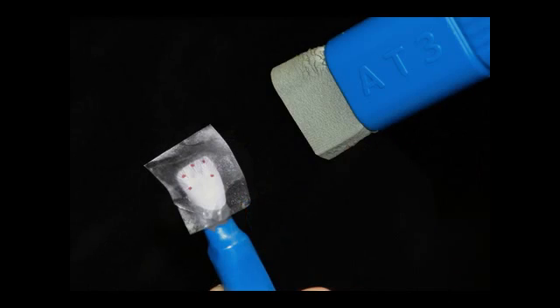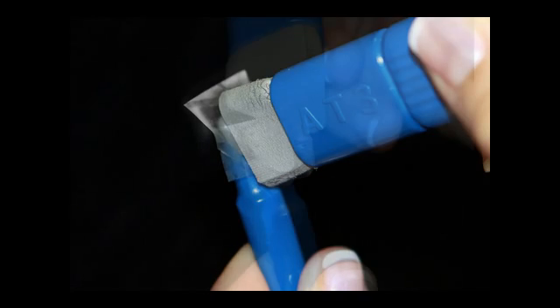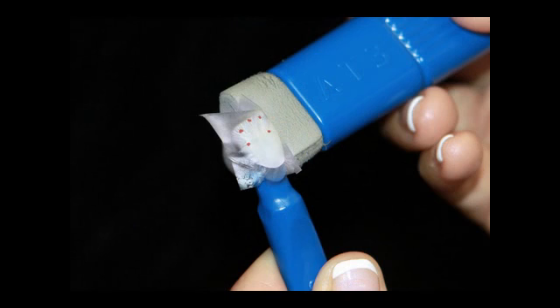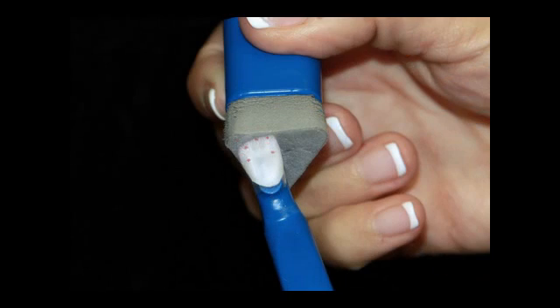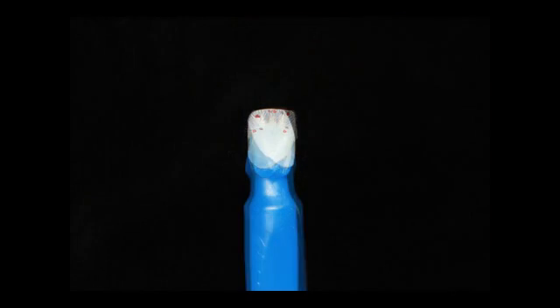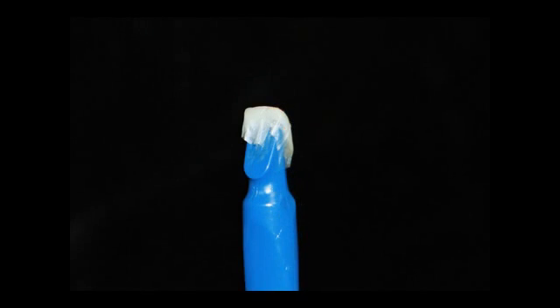It is very important to avoid trapping any moisture or air bubbles between the Gila digital transfer and the surface of the tooth, as this will cause a bubbling effect on the final result. Do not worry about any extra material past the margins, as it will burn out clean.